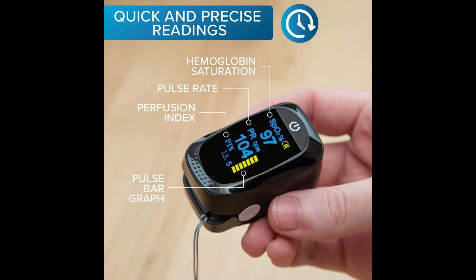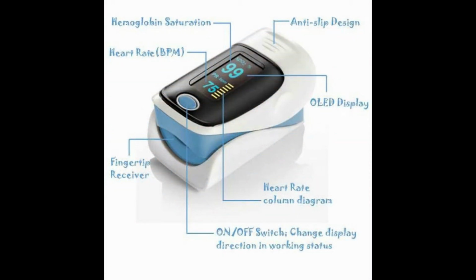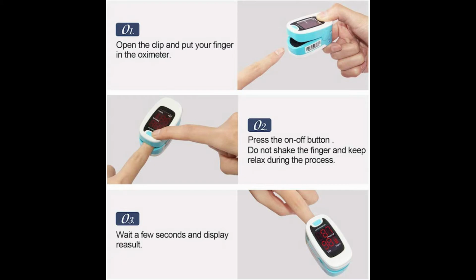Now that you have a better understanding of the oximeter device and how to understand the readings, let's understand why this device is important for a COVID-19 patient. The reason is, a pulse oximeter may indicate issues with blood oxygen levels which could be related to coronavirus, because COVID-19 is not the only disease that causes low blood oxygen levels. A pulse oximeter is recommended for the early detection of COVID pneumonia, a potentially deadly condition seen among the most severe coronavirus cases, but keep in mind that other diseases like chronic obstructive pulmonary disease, COPD, asthma, and other non-COVID-19 lung infections can also result in low oxygen count.